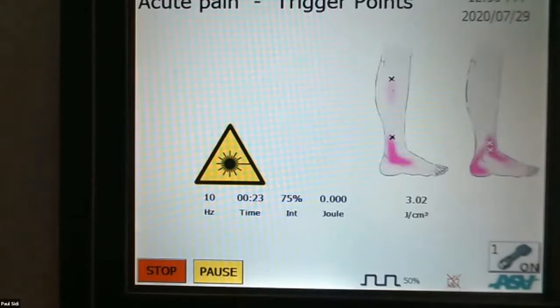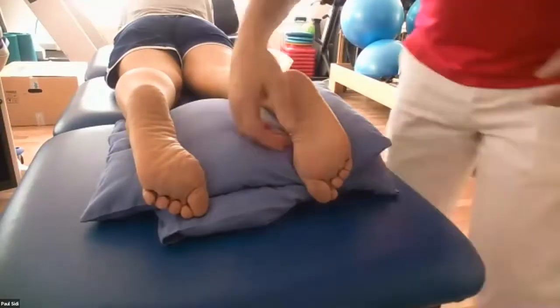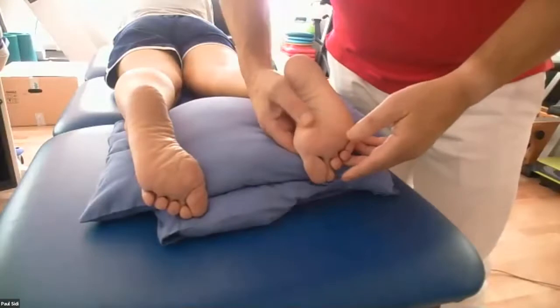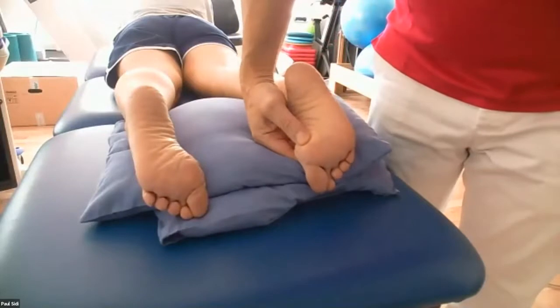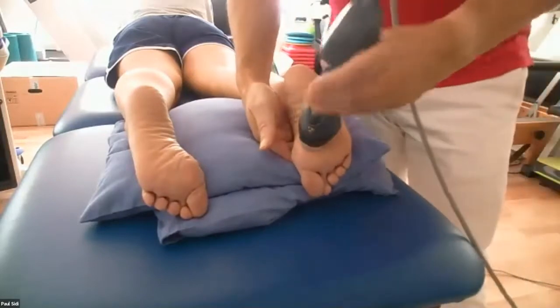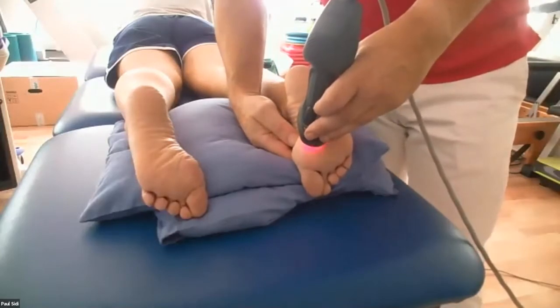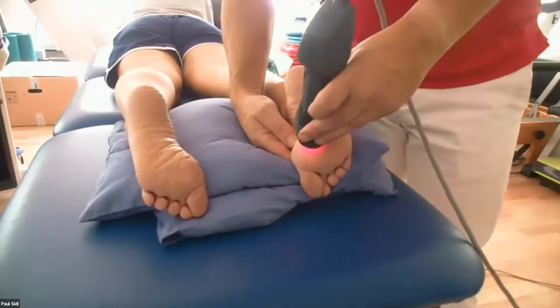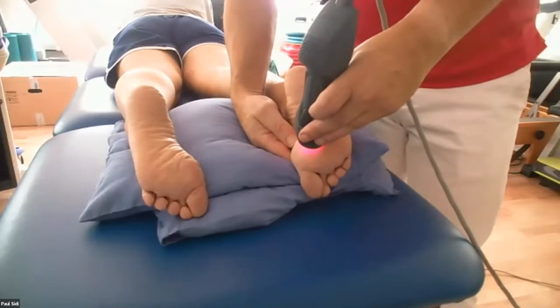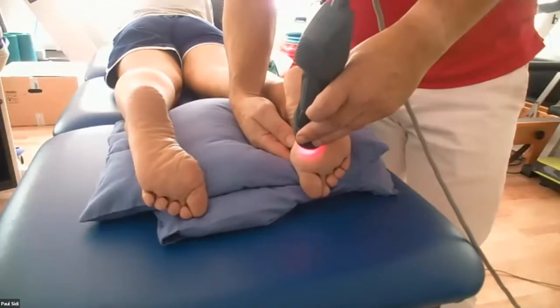Going to come over here to the patient again. Okay, and remember what I said to you. We've gone back in here and pressing in here, and it was bloody painful still. So what we do is, I can feel this. We're just going to get this on here. And press that. You can probably see it's virtually flashing. Okay, the very, very acute setting. We'll put that on there, 23 seconds. And this is actually pretty clever because it does work.